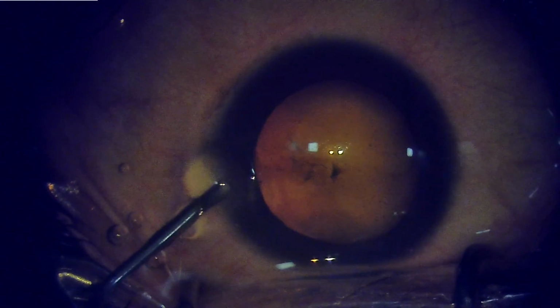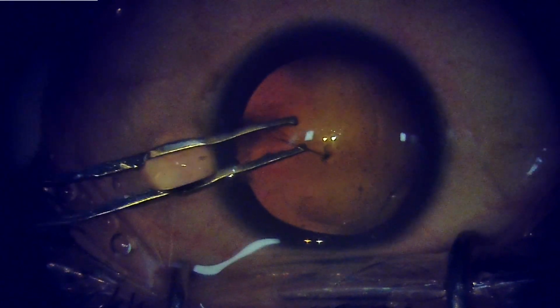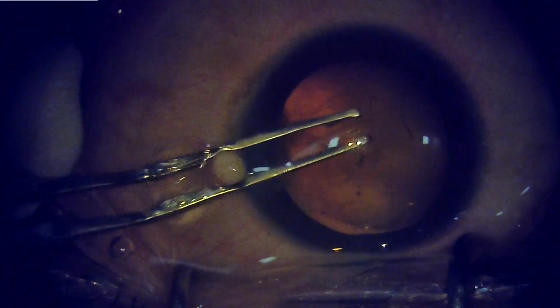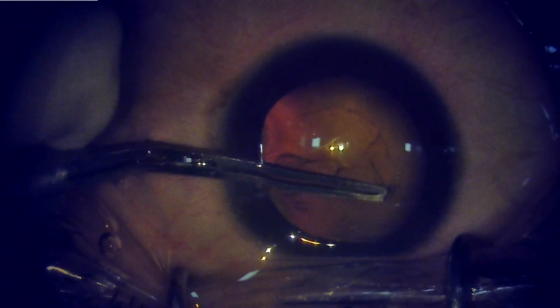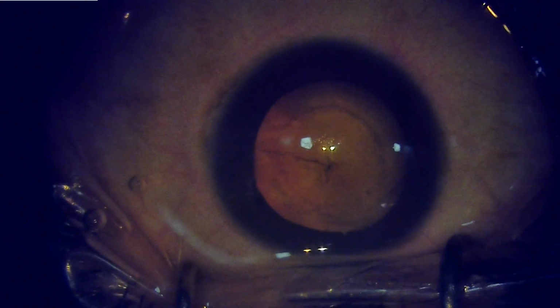In the meanwhile, the eye which was operated, the right eye, was patched for a while, and the surgery was done similarly for the other eye, taking care that there's low illumination at the start till we have done the hydrodissection, so that the patient is comfortable and able to cooperate well.